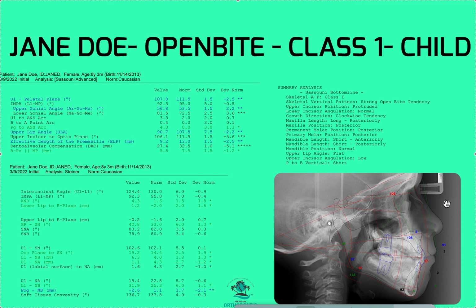If I saw this 8-year-old come into my practice, I'd 100% first of all need to do maybe an OMT eval, maybe send to ENT. There might be something you can't just address with ortho alone. There might be habits. We would do an SDB eval. This is not something you could just slap some braces on and fix. There's a lot going on here. And if you do not intervene with this patient, the patient's going to have some funky growth and some funky airway issues that are going to have to be corrected with jaw surgery. So it's really important to catch these patients and to intervene quickly.